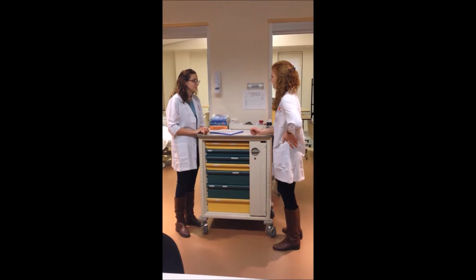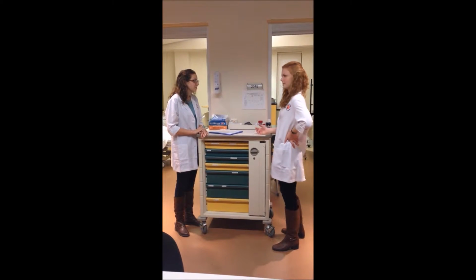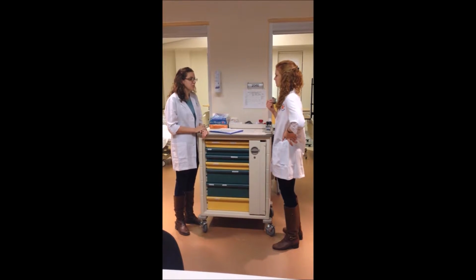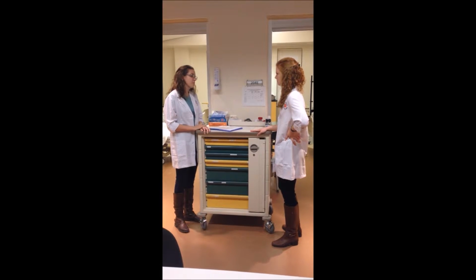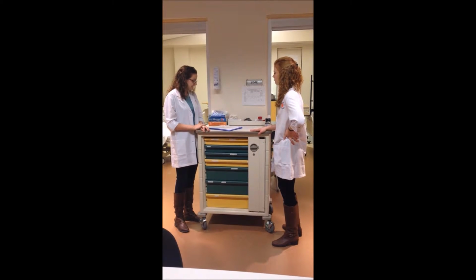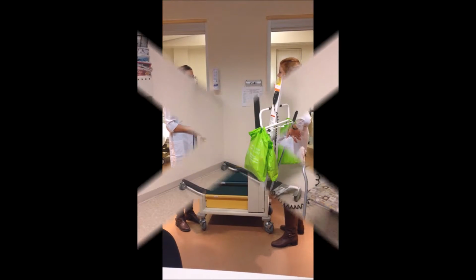I really hurt my back yesterday lifting one of my patients. Why don't you use a patient lift next time? What's a patient lift? A patient lift is a mechanically powered device that helps move patients from beds, wheelchairs, showers, to other surfaces, helping reduce the strain on our backs. The 4 types of patient lifts that we have are a stand assist, a mobile, a wall, and a ceiling lift. Okay, I think I'll try using one of them.